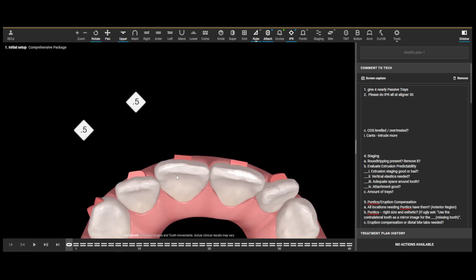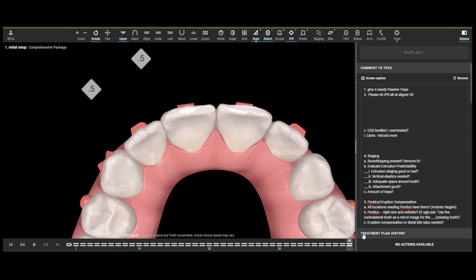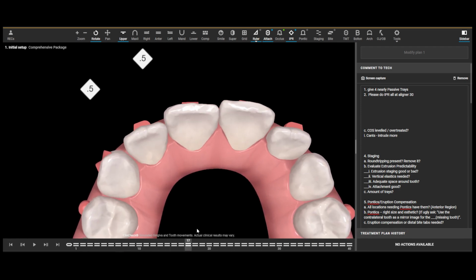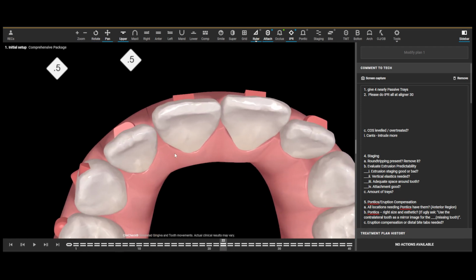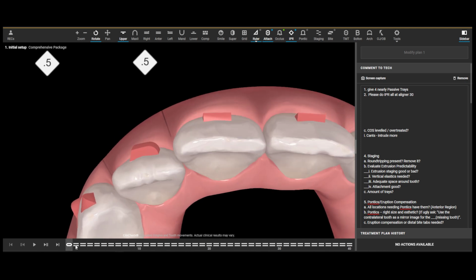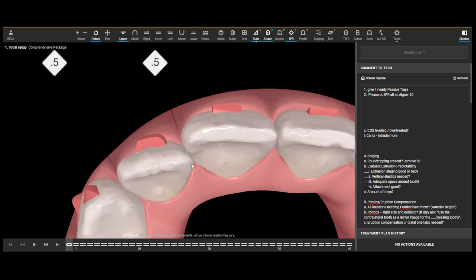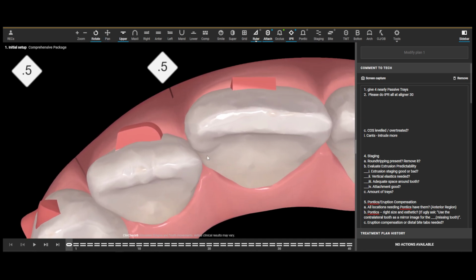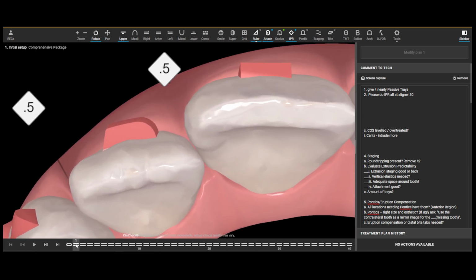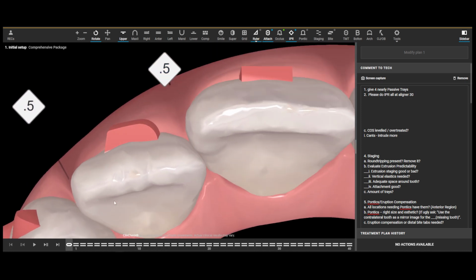It's all right that the teeth are moving one direction and then moving another direction, because we want to first derotate the teeth and make sure we don't have tight contacts between them. That's one of the main reasons that teeth don't move, is they're hitting up against each other. So a really crowded or rotated tooth, it can actually be a good strategy to tell the technician to leave a little bit of space around that tooth as it derotates.